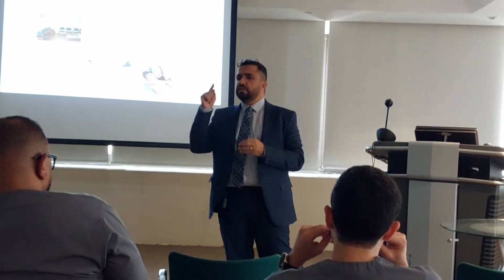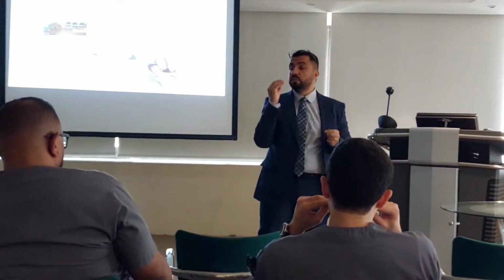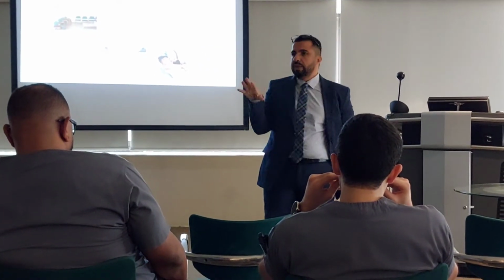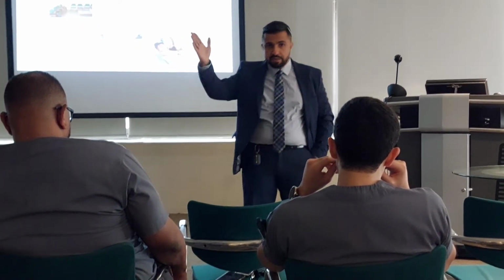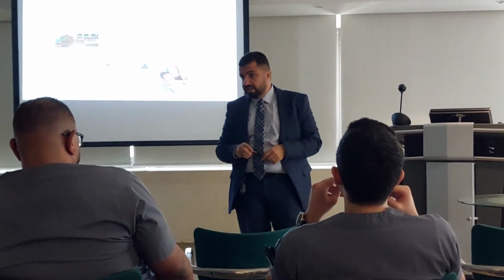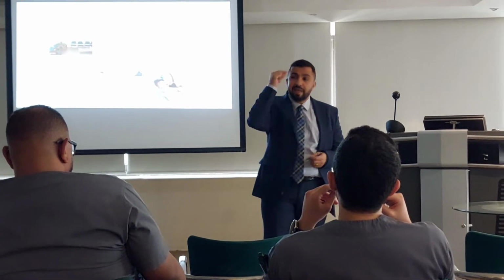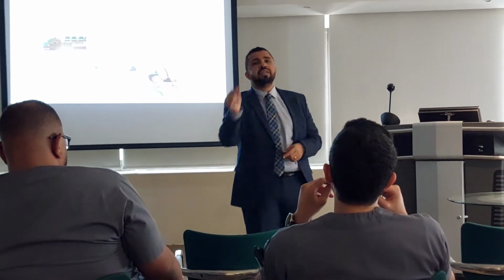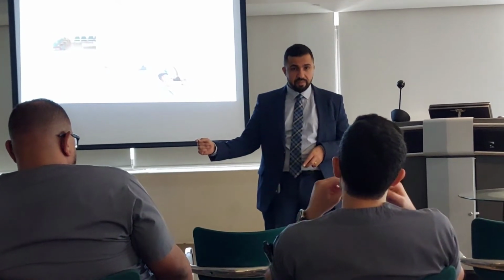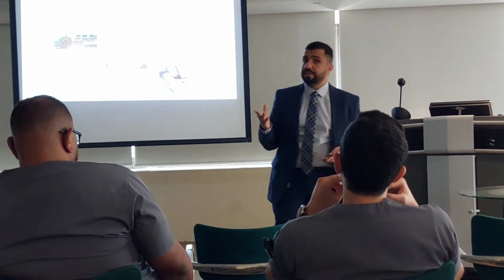At the appointment, I should check, or the doctor should. We already trained the cardiologist to write it. You ask him, and it's not the same as their cardiac ECG. For them, they don't ask the patient to hold his breath. For me, I need to know the ECG rate while he is holding his breath. You get that? Exactly. So this is the way.